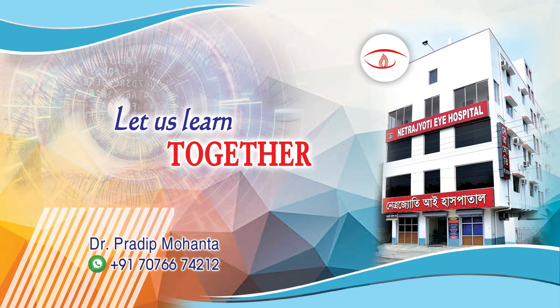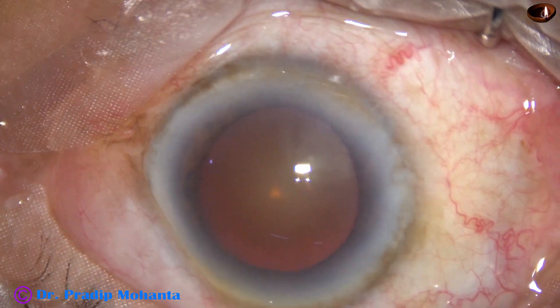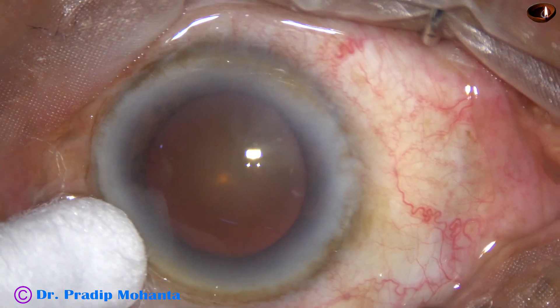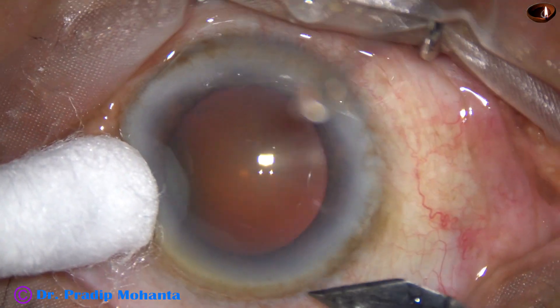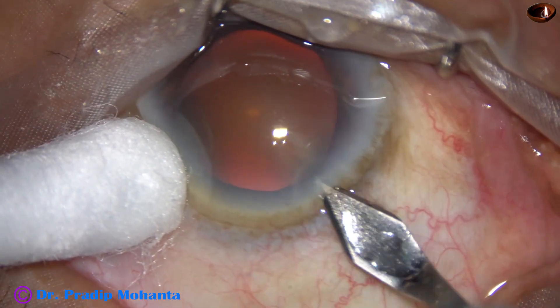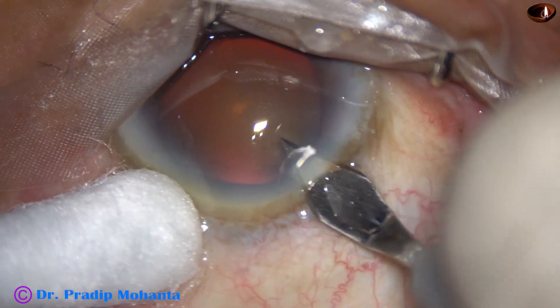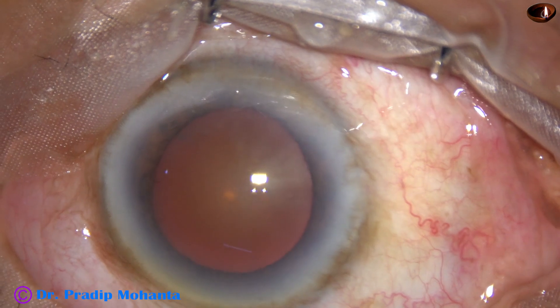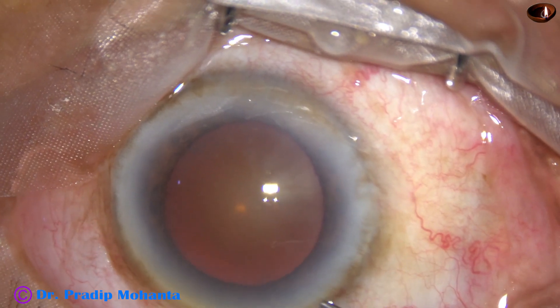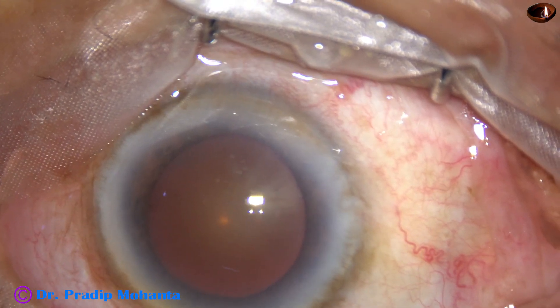Friends, welcome to my workplace at Ranagh Heart, West Bengal, India. This patient is 95 years old. This is the left eye of this patient. I have done surgery of the right eye about 10 years back. Let us observe this surgery. The patient has mild eye faze.